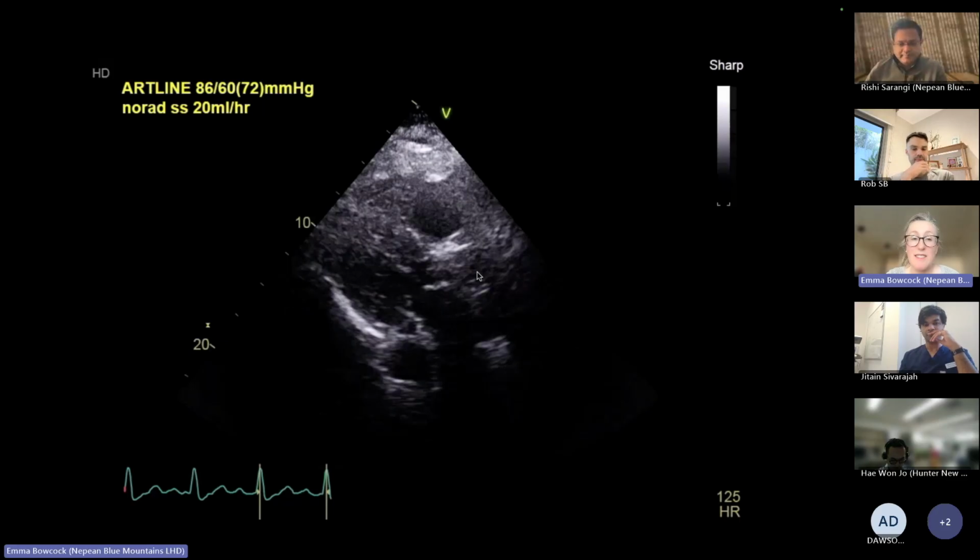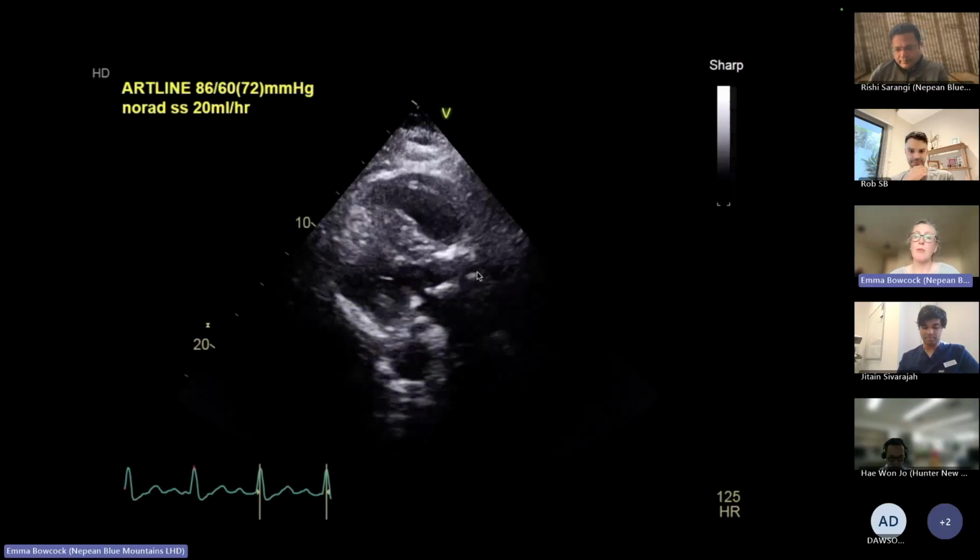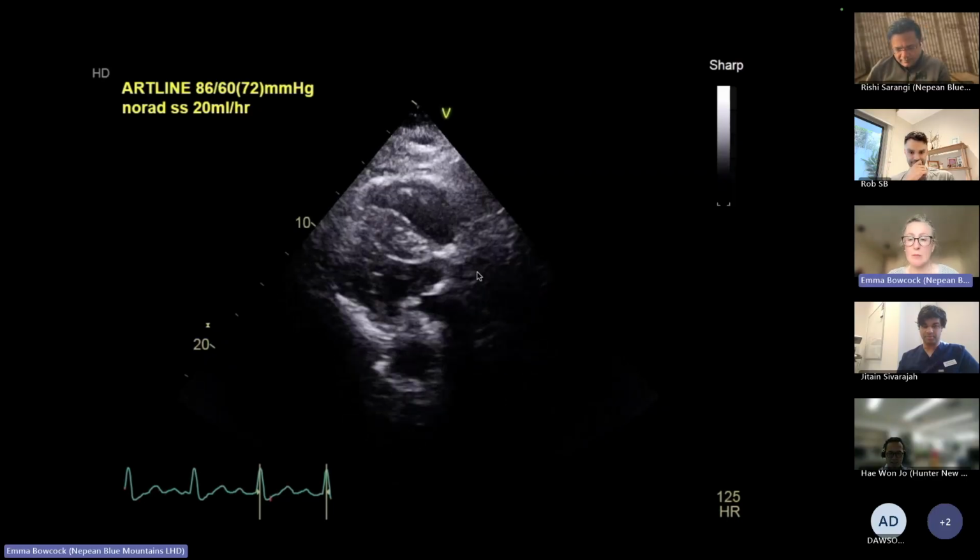So this is a 90-year-old man admitted to the unit after a procedure. I'm not going to tell you what that is. The handover is that he remains intubated, but he's desperate to have the tube out, but he's had escalating noradrenaline requirements and he's still got a very cool left leg. So you echo him on your ward round, Rishi?